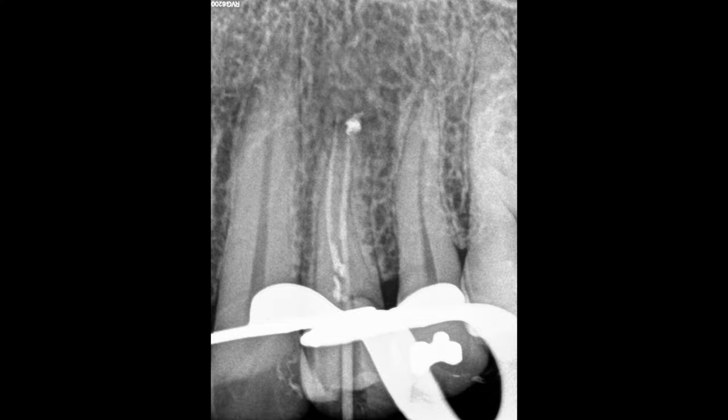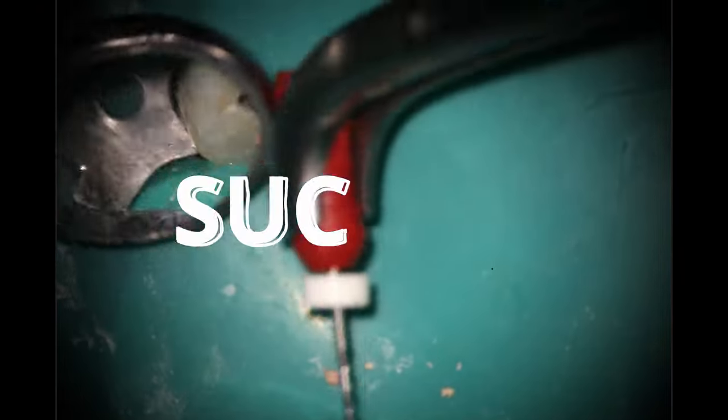There's still that little piece in the isthmus, so let's go after it again. The Hedstrom seemed to do the best job. You can see I'm getting a little piece out of there — I put a 90-degree bend on it to try to grab it a little bit more. You'll see it pop off here in one, two, three. Slowing that back down so everybody can join in my enjoyment of getting that piece out. Now we have two beautiful circles of pink for the picture.